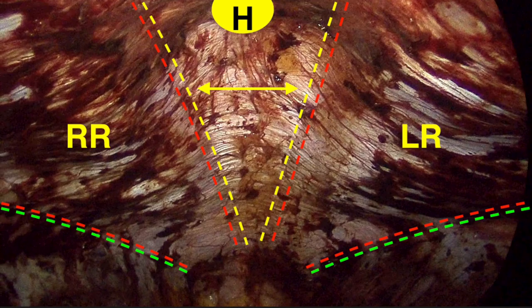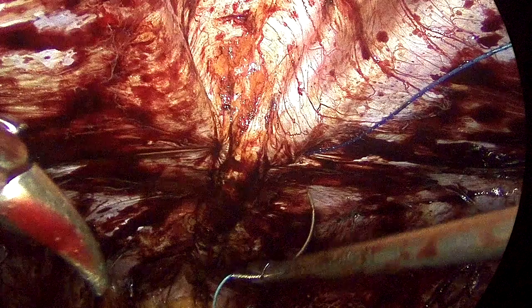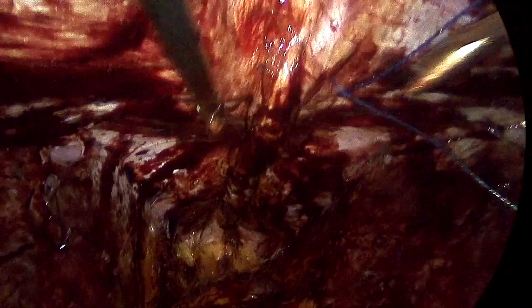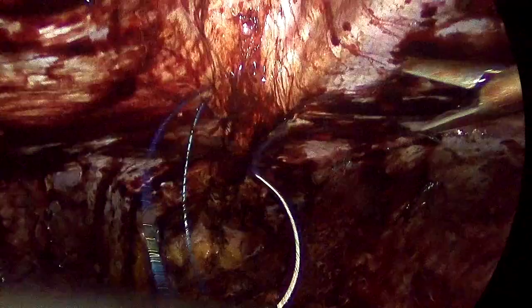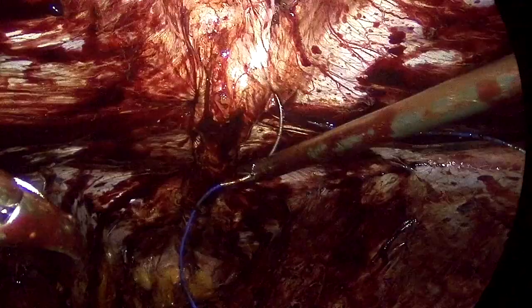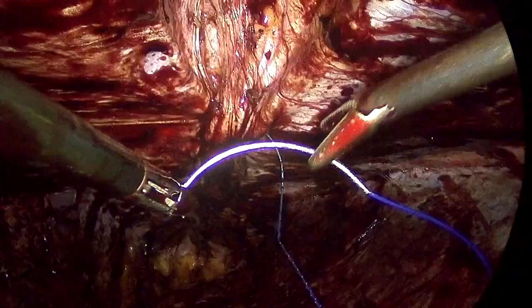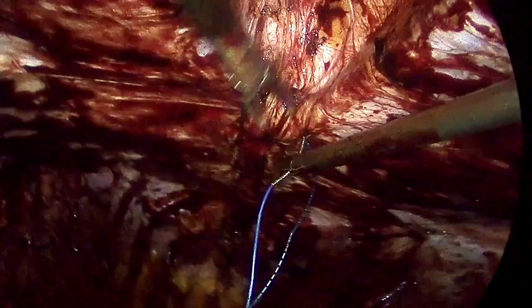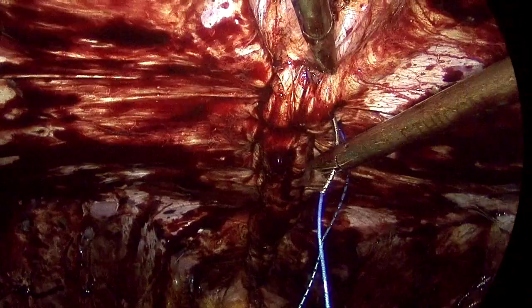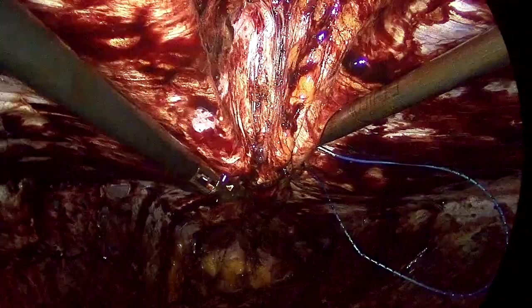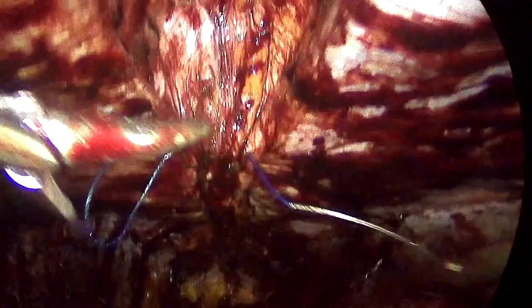She had a diastasis that bulged a lot. We're doing throws coming side to side in a horizontal mattress fashion. I am bringing the fascia with my accessory instrument into the abdomen to make sure I grasp the whole thing, and I lock the suture every now and then to make sure it's not going to run back accidentally.